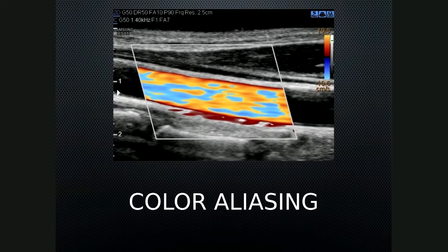So the first thing, again, you look at is this color map and make sure it's set at least 40 for an artery. Now for a vein, it can be under 40, but at least 40 for an artery. And that's the first thing you're going to do. So they show you a picture like this and say, how do you fix that? And there's going to be an actual panel of controls that you're able to click with a mouse and make the adjustments.